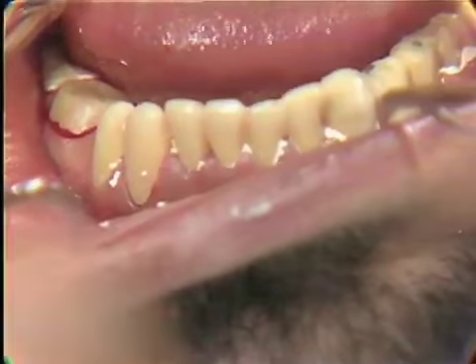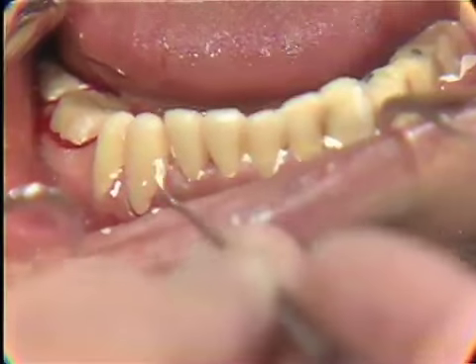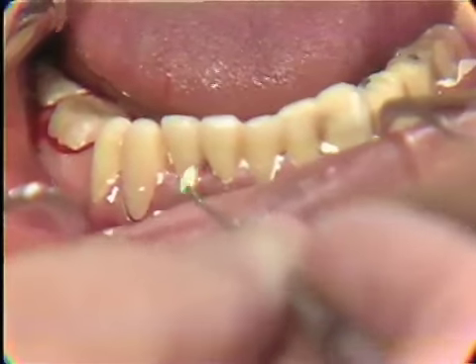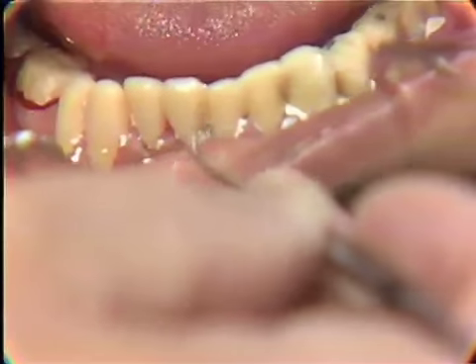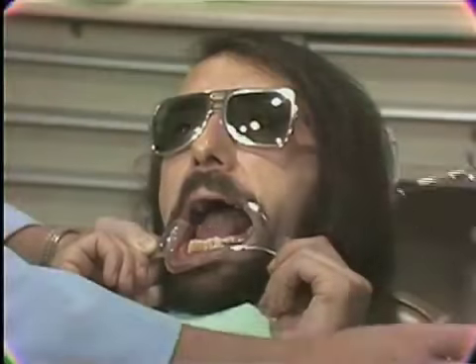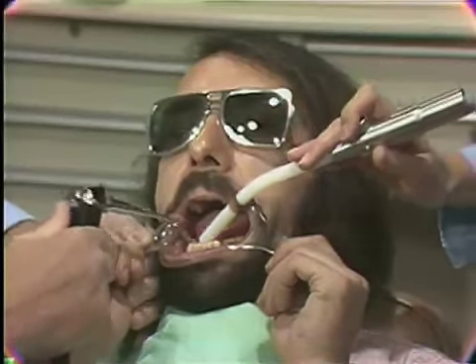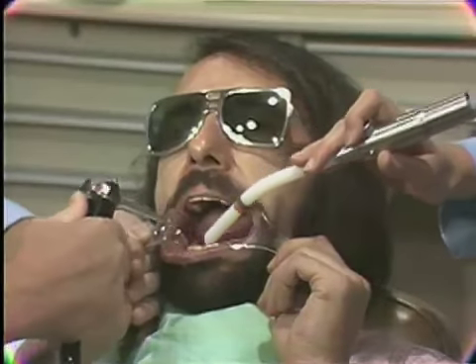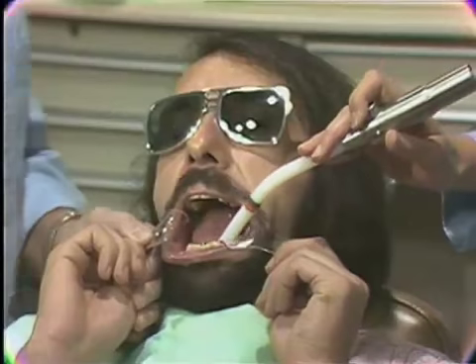Then go in the embrasures with an explorer and make sure that you get all the material out of there, especially on temporaries that are luted together. Remember that the patient cannot get in between the teeth to clean out the temporary material, so you must get the material cleaned out.